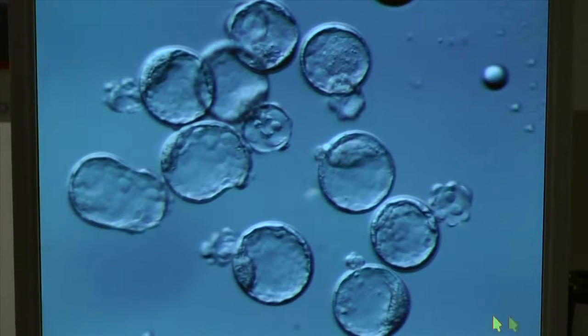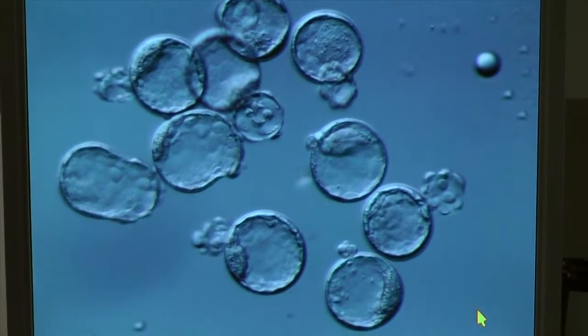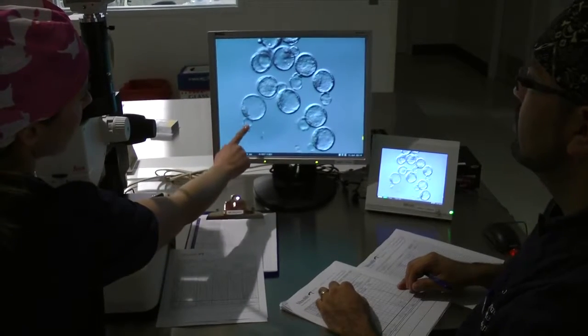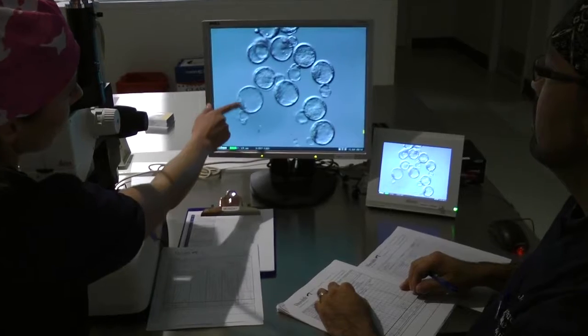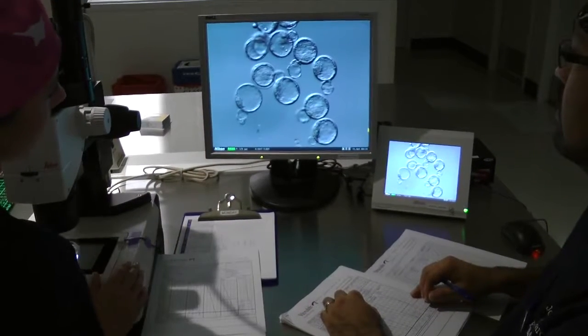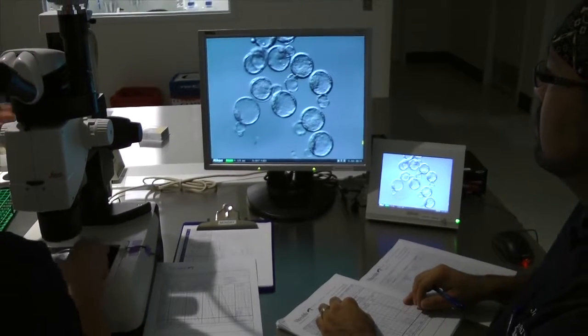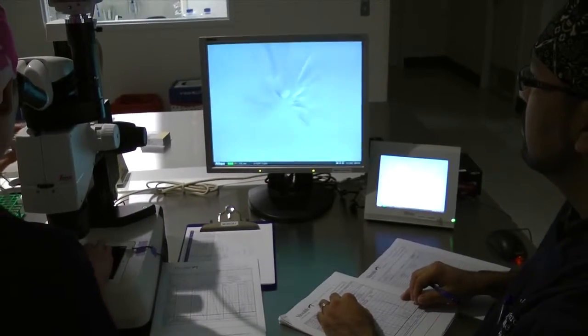An assessment is then made between the test and the control to determine whether or not a material will be passed and utilized in the manufacturing process. This is also performed for the finished product, and this allows us to determine whether or not a finished product meets our quality standards. Over the years, there's been a transition from the 2-cell mouse embryo to the 1-cell.